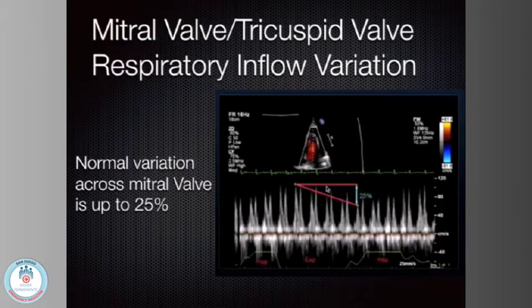And then I look for the V peak max and the V peak min. The V peak velocity max, and subtract that from the V peak min. And if it's more than 25%, then I worry that there's pulsus paradoxus or pericardial tamponade. Are you with me?